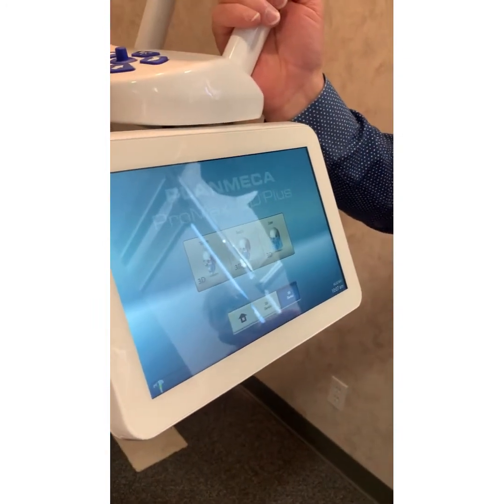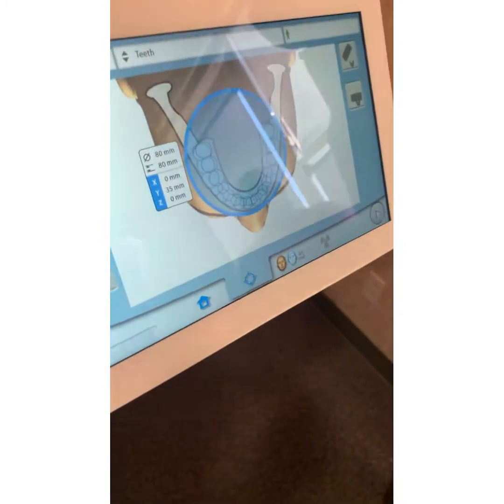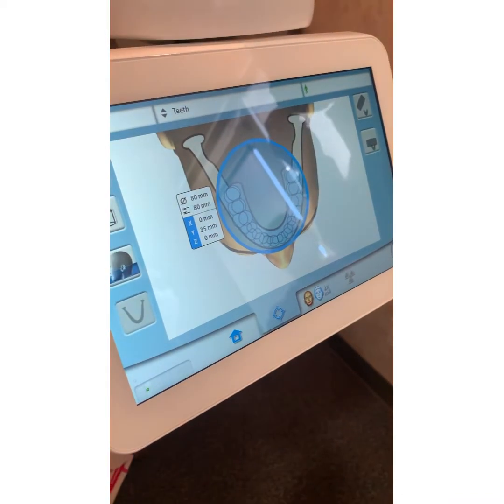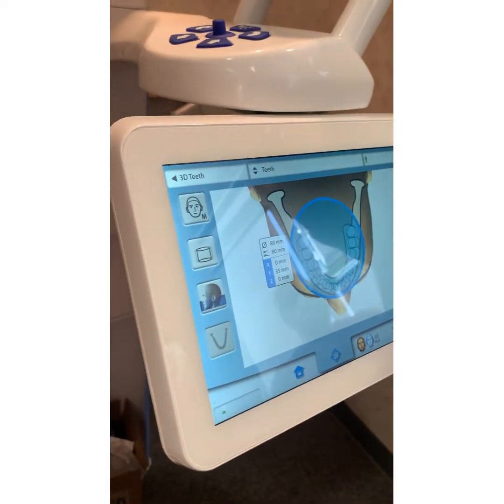But I get plenty of calls. I'm not getting enough. So initially, before we get good at targeting, and endodontists have changed too. Before, they'd say, I got a 3x5, can I make that any smaller? No, you can't make it any smaller. It's 3 centimeters by 5 centimeters. You're going to get a couple of units here instead of just 1 tooth. However, as time goes by, endodontists now see the value of getting opposing dentition, adjacent dentition.